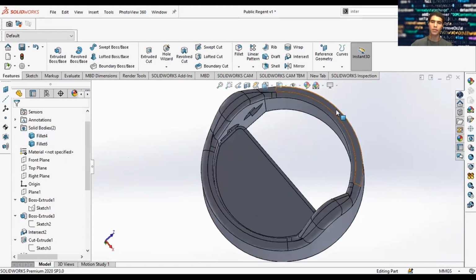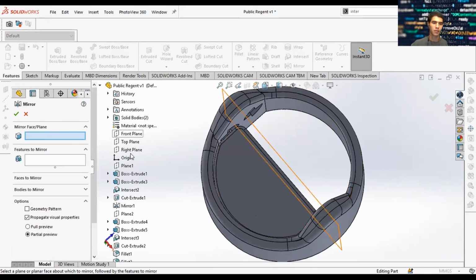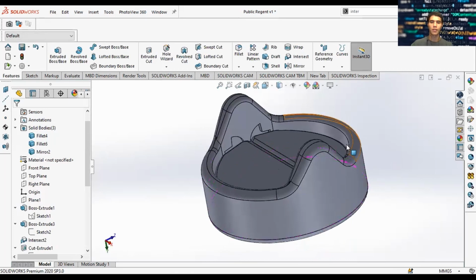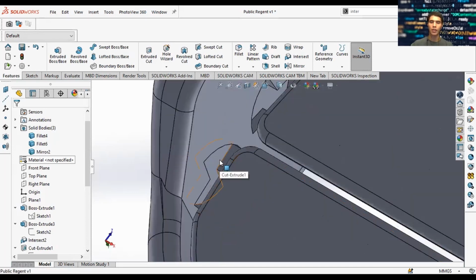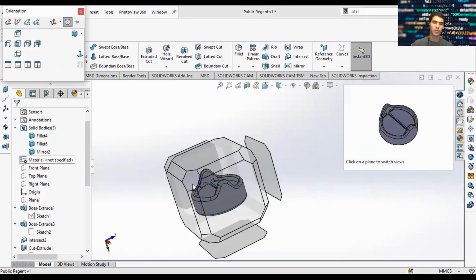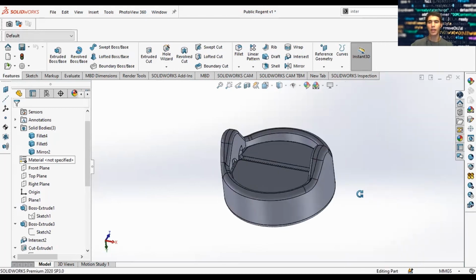done for both bodies. And you're like, well, that's only half a leaflet. I want both of them, right? So go back to mirror, choose our front plane, just mirror the body you want to mirror, and you're done. Most of the design's done there. So one thing you know is that there's no actual attachment between these bodies to the mechanical valve. So you probably need to extrude a body there so it can fit into the hinge. But for demonstration purposes, looks nice. So what's next? You want to add the cuff.